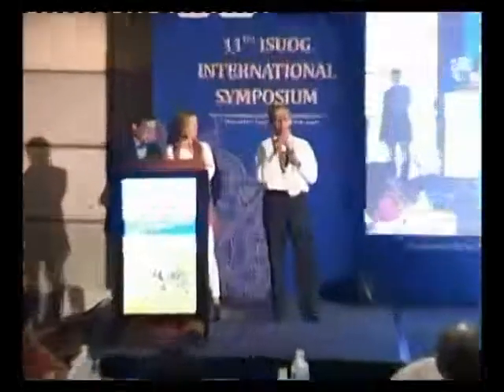The most important thing is that you can't depend only on thickness, only on morphology, or only on the endomyometrial interface. It's a combination of all these things. That is the reason why the terms have been defined, and each one has its own importance. Suppose, in such a situation where there is a history of tamoxifen and the endometrium is thick, naturally with your clinical background, you know that there is the possibility of endometrial hyperplasia. Where we have a strong suspicion of an endometrial lesion or malignancy, I think saline infusion sonography will definitely be helpful before doing an invasive endometrial biopsy.